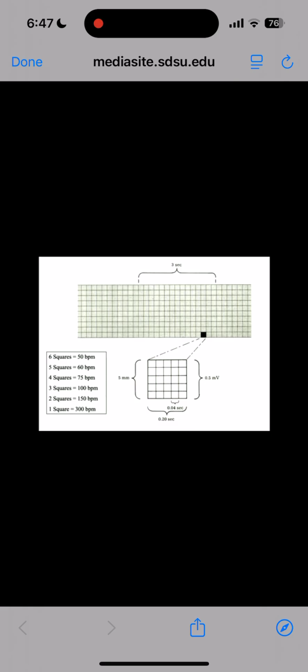So to give you an idea of this, first off, arrhythmias are going to detect an irregular heartbeat, okay? An arrhythmia, and I don't have an example of this, if you had a QRS complex here, then one way out here, then one here, and it was all over the place, that person would have to be in an ER immediately.